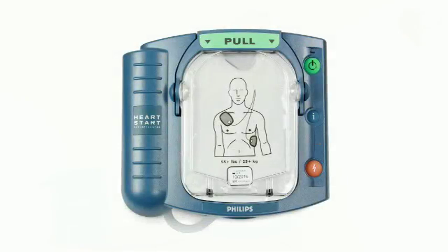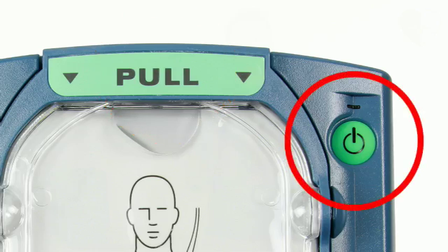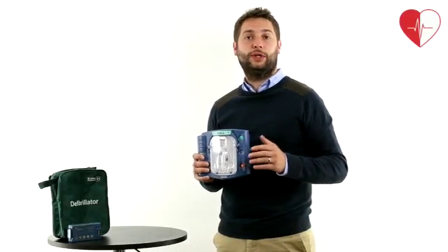The Heartstart HS1 is small and sleek and features step by step voice commands. When the pull handle is used at the front of the unit, or the power button is pressed, the voice commands will prompt the user how to apply the pads and begin treating the patient.